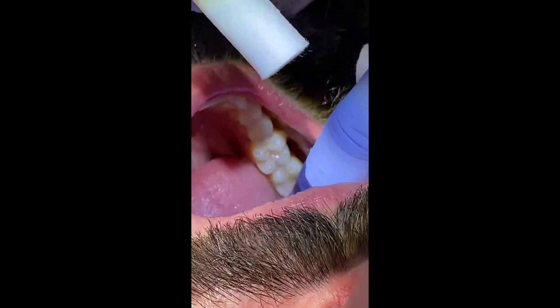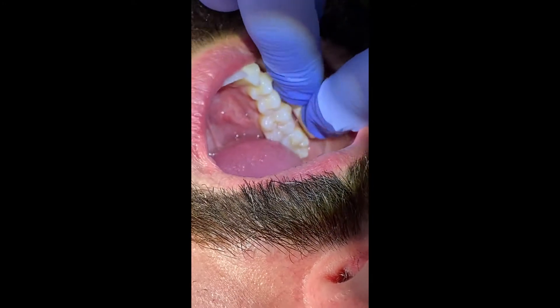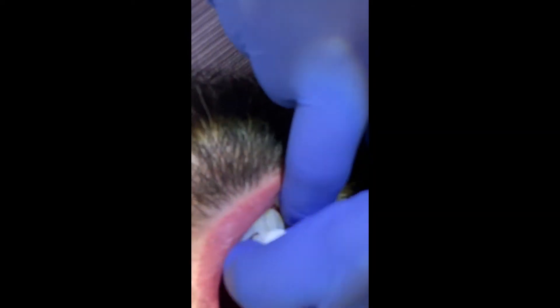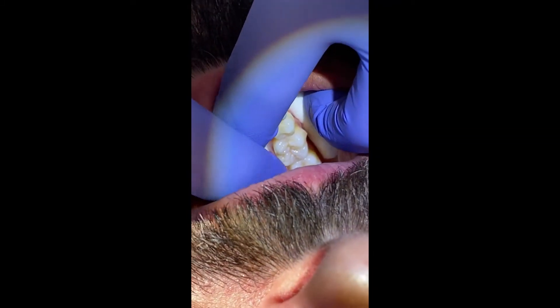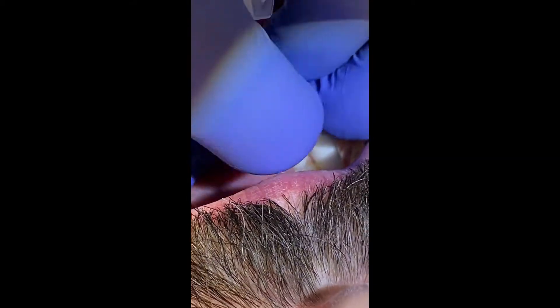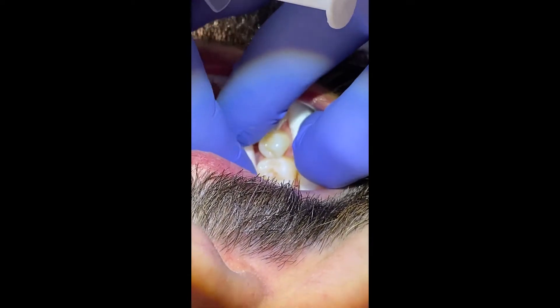The first step we're going to do is to isolate before we etch. I'm going to retract the soft tissues and place a cotton roll deep within the vestibule of the cheek. I'm also going to place a cotton roll next to the tongue. Go ahead and open for me. We're going to reposition if we need to, to make sure that tongue stays away.